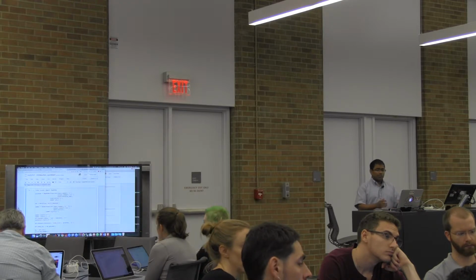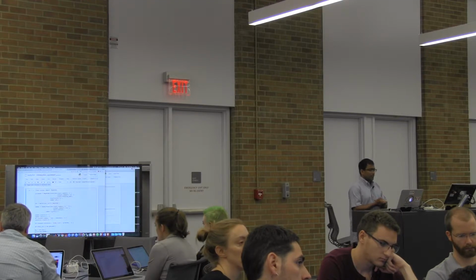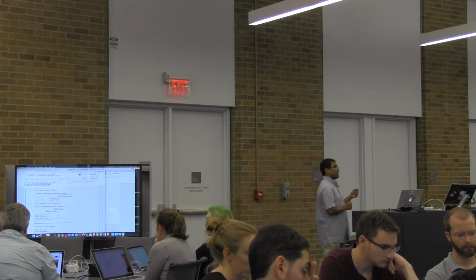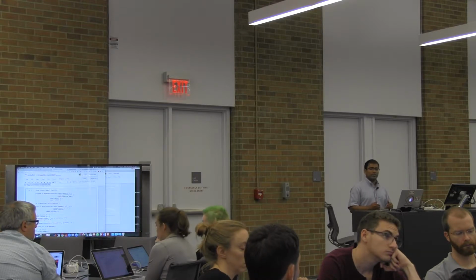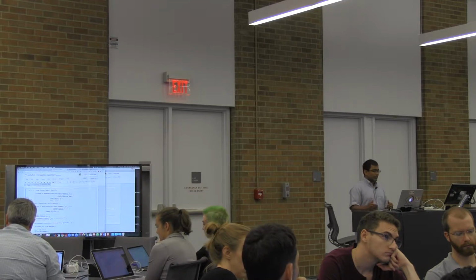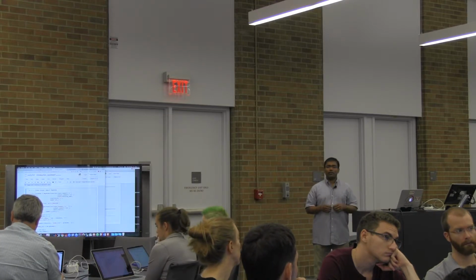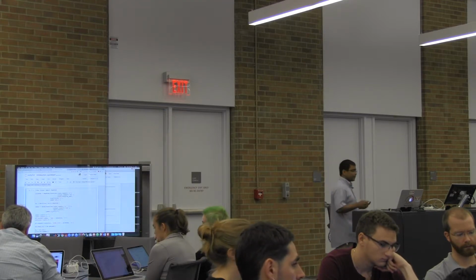The construct for a map node is exactly the same as we did before. Instead of node, we are using map node, but we add this additional attribute called iterField. What iterField tells map node is, whatever input you're getting on this port, iterate over it. So that's how map node gets to run different things. And we're not going to go into details of iterField, but you can have parallel inputs or parallel sets of inputs that you would run in parallel. So it can make sets of inputs that it will run the interface over separately.